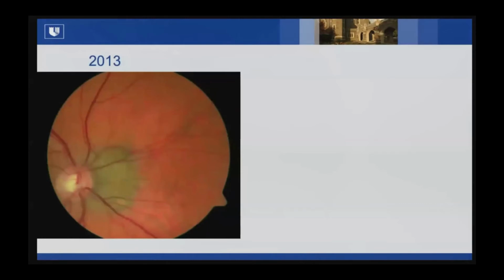In 2013, this 75-year-old gentleman showed this juxtapapillary choroidal melanocytic lesion with some suspicious area for lipofuscin. There were no symptoms, no retinal detachment. This patient was followed.